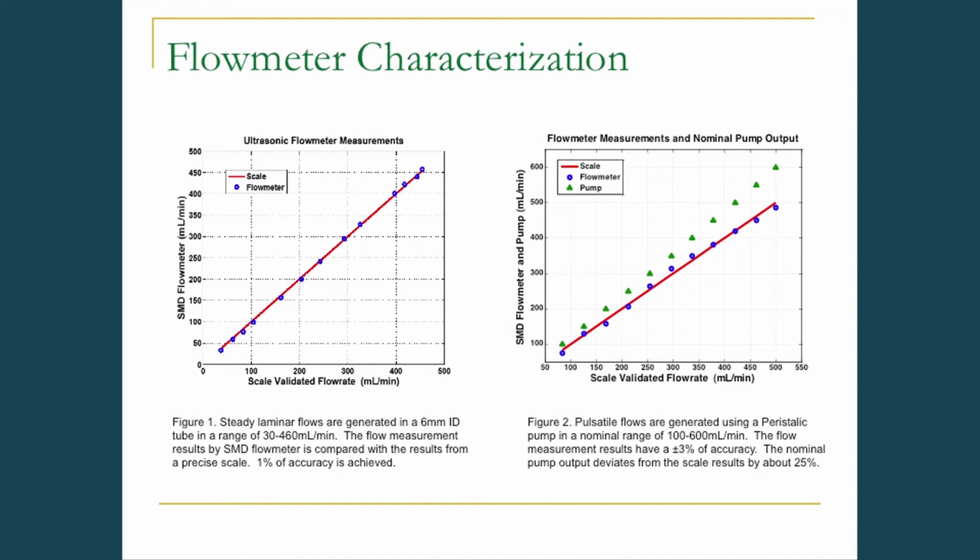On the right-hand graph was pulsatile flow. So you'll see on the next slide what pulsatile flow looks like. Actually, I'm going to just flip to that in a second. So if you look at, say, the lower left graph, that's what a pulsatile flow looks like. So if you look at this graph on the right, what we're doing is we're integrating under that curve and measuring the flow rate over some period of time. I think in this case we did it over about 30 seconds to a minute.